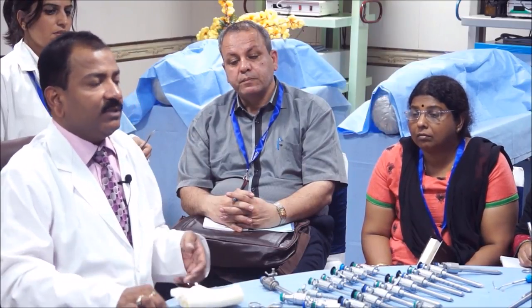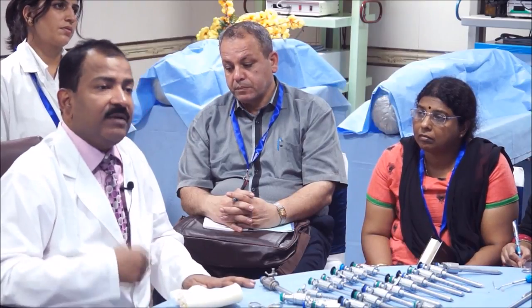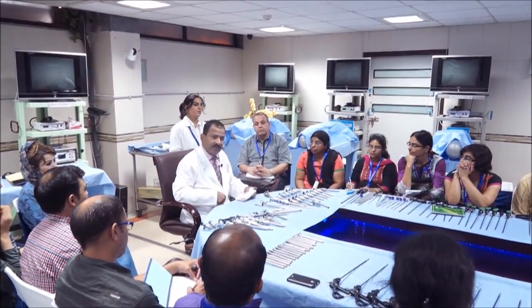Do you know why? With morbid obesity, the umbilicus is displaced down. Sometimes if the patient is super morbidly obese, like WWF, sumo wrestlers and all, their umbilicus is up to the level of the scrotum. Because it is displaced so much down, you see they are holding with a cloth, supporting their abdominal wall. So for those patients, you may have to go supraumbilical. That's why in bariatric surgery, we don't consider the umbilicus as a point of relevance. We consider from the xiphisternum. From the xiphisternum, your port should be 20 centimeters below. It depends on where the umbilicus is. It may be 5 centimeters above the umbilicus, maybe 10 centimeters above the umbilicus, depending upon how much the umbilicus is displaced. That's why we consider 20 centimeters below the xiphisternum.